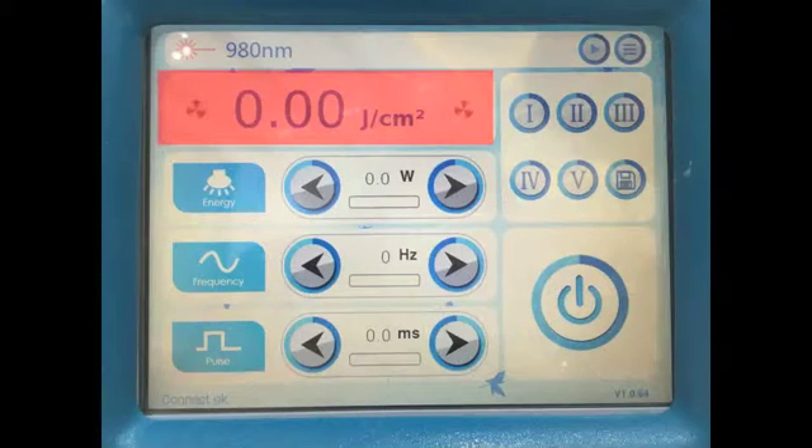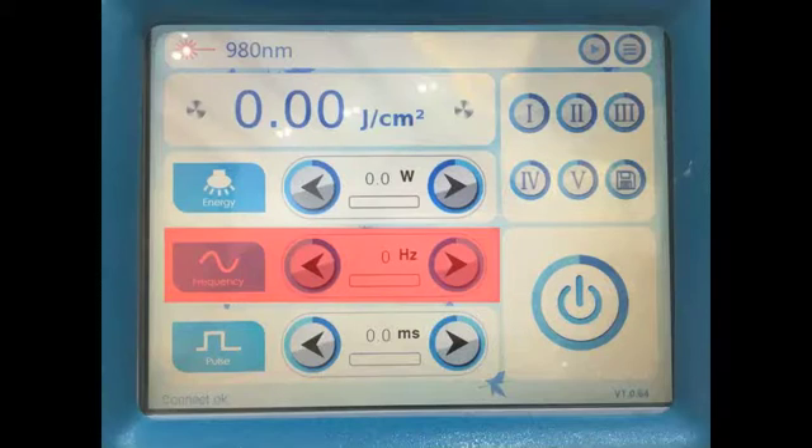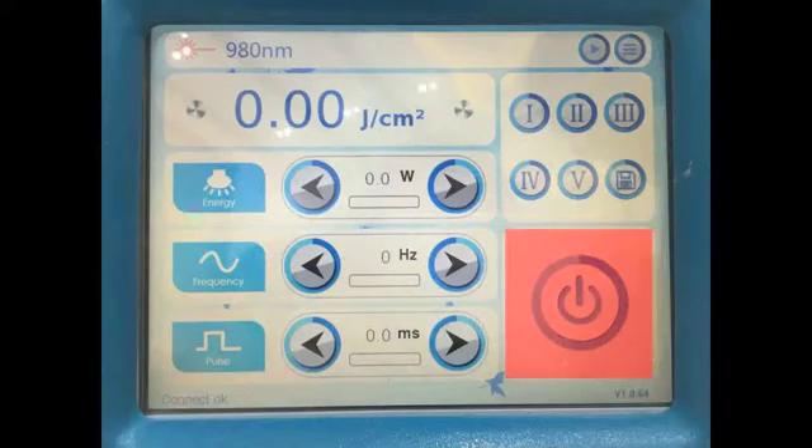The operation interface displays: real energy density, energy, frequency, pulse width, and 5 data storage slots. There is also a save button and a ready button.